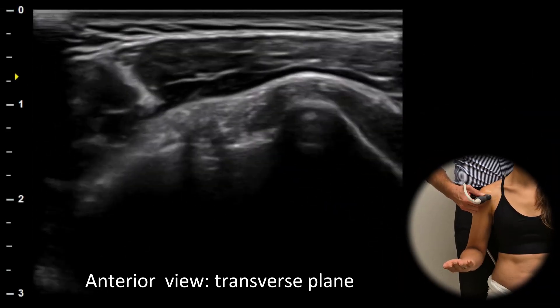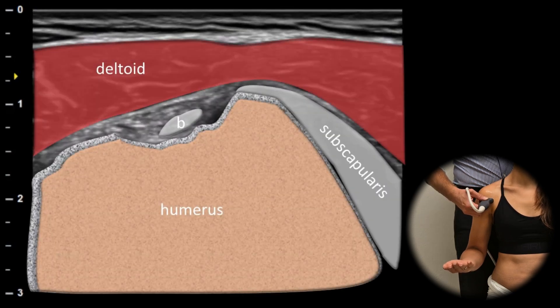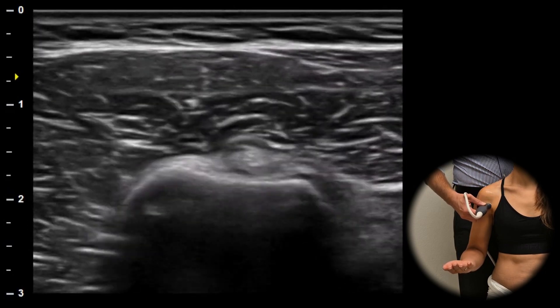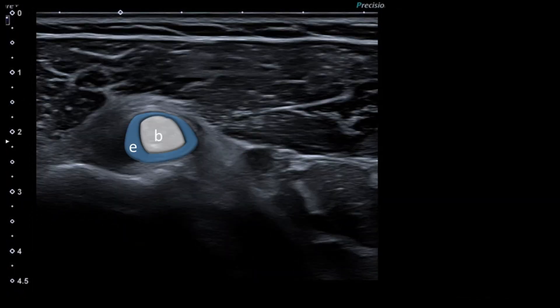Let's start with the anterior shoulder in the transverse plane. The space around the long head of the biceps brachii is the lowest part of the shoulder joint when the patient is sitting or standing, so fluid often collects here. Look for a hypoechoic or anechoic area around the biceps tendon during scanning.